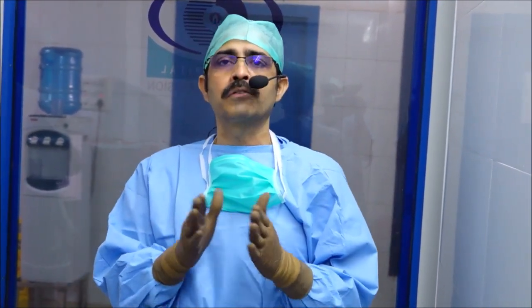Black cataracts have some limitations as I mentioned, but still most cases will benefit. I am not incorporating the corneal incision step here, but people say if you incorporate it, the corneal incision quality is very good and very useful. Our arcuate incisions are really useful in cases of 1 to 1.5 diopter astigmatism where I can just treat it with the femto laser-assisted approach.